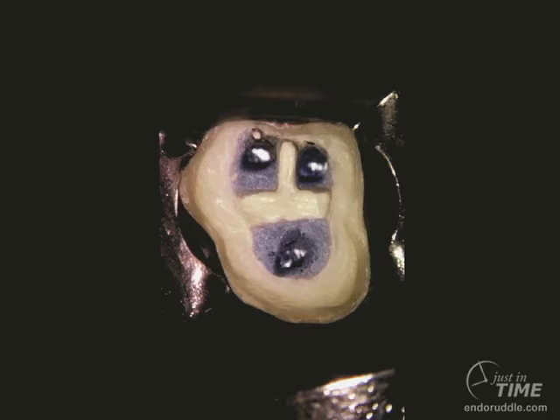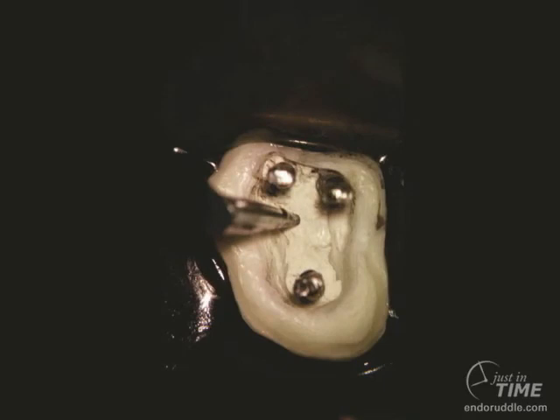In this case, we see a change in color, which means we're going from a composite buildup to some kind of cement on the floor. Continue to remove buildup with your rotary cutting burs like a surgical-length number two, but at some point when you're working in tight spots between a post and an axial wall, use ultrasonic instruments because they're about ten times smaller than the smallest rotary cutting tools.